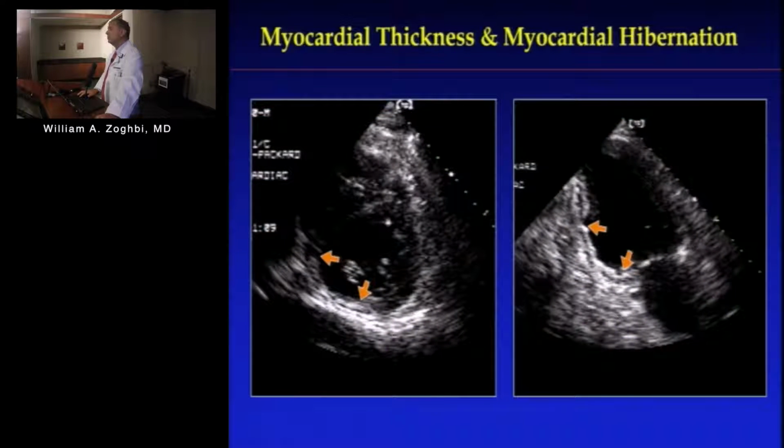And most people, to tell you the truth, do not do the quantitation. They go by qualitative changes from rest to low doses to higher doses of dobutamine. From a safety point of view, nowadays we really prefer not to go to the 40 mics, etc., particularly if the ventricle is really very bad. So yes, you'll take away some of that specificity, but I think we've seen some cases where VTAC was induced. These are a minority, but I think with other situations or other technologies that can give you that information, I think we're shying away from this maximal, high dose 40 mics dobutamine and atropine to be able to induce the ischemia and looking at the lower doses.